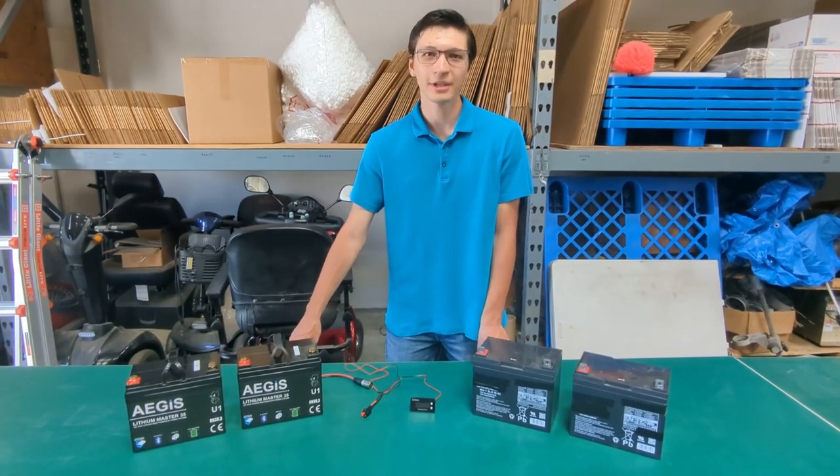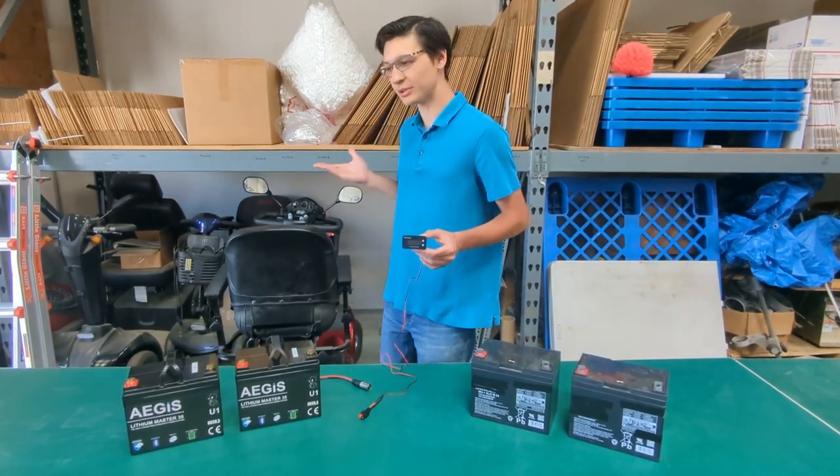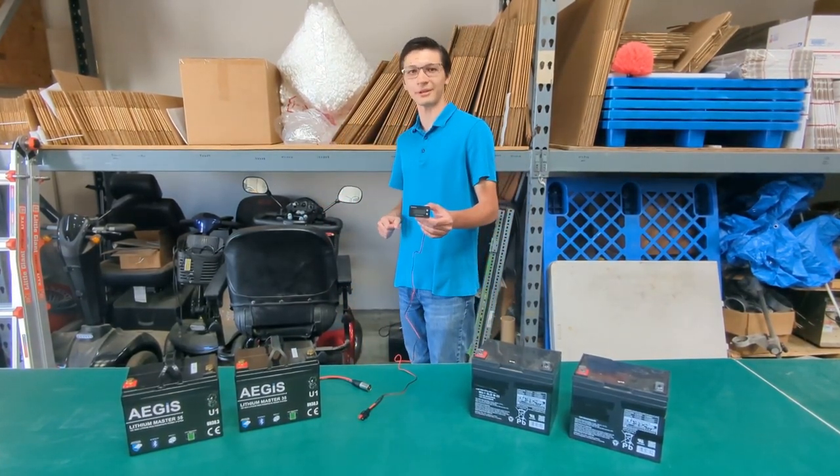Hi, Jacob Dages of Battery here. Today I'll be showing you how to use a new battery meter when upgrading your mobility scooter to use our more powerful lithium batteries.